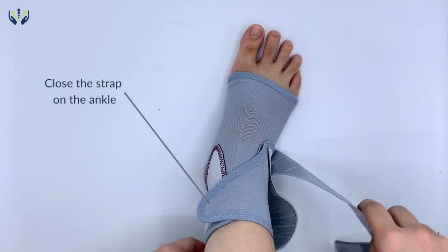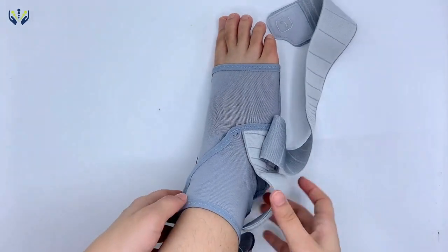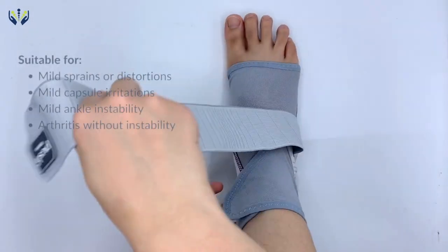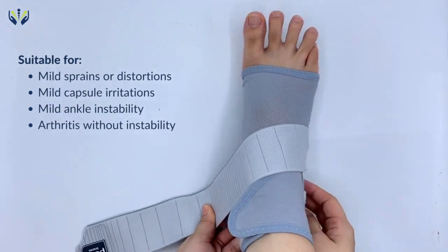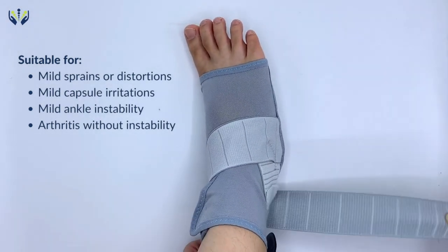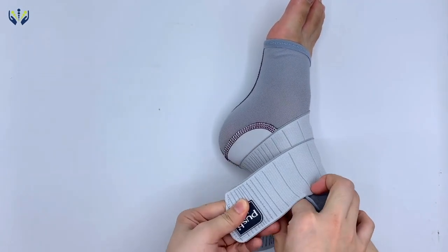This ankle brace provides exceptional pressure around the ankle, improving the stability of the ankle joint. This ankle support is very effective for the treatment of mild ankle injuries when a degree of support and compression is required, but without the need for a rigid splint.